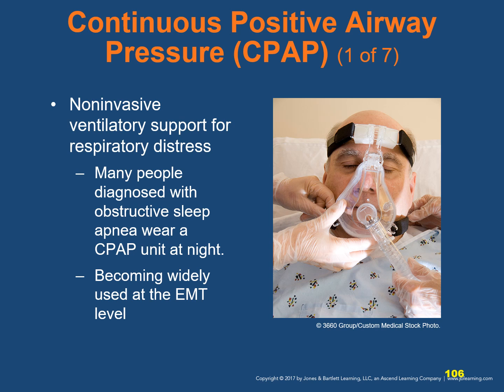Now, let's talk about continuous positive airway pressure, or CPAP, which is a non-invasive ventilatory support for patients experiencing respiratory distress. Many people diagnosed with obstructive sleep apnea wear a CPAP unit at night to maintain their airways while they sleep. CPAP is also becoming widely used at the EMT level.